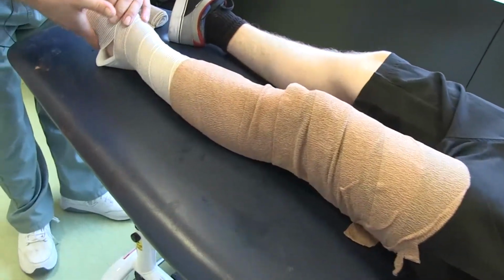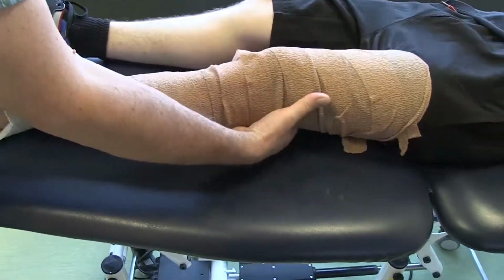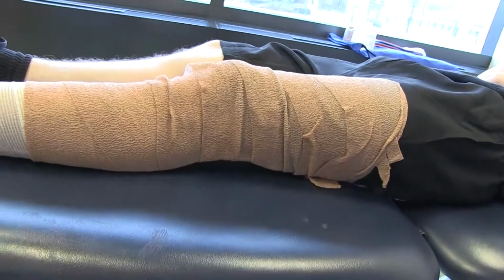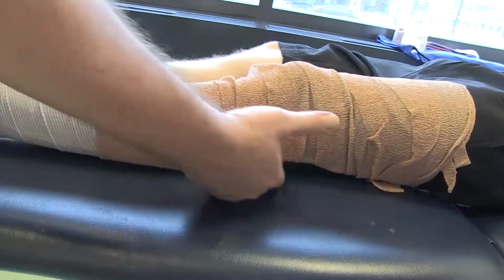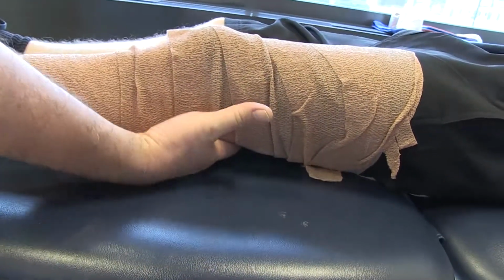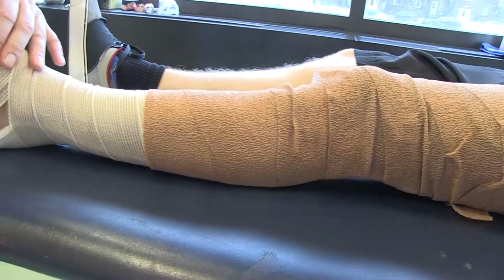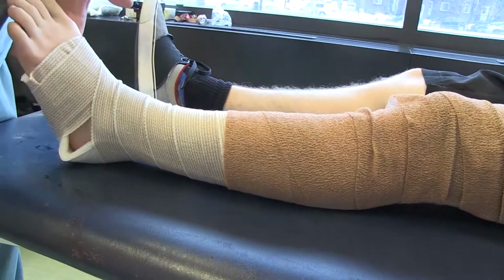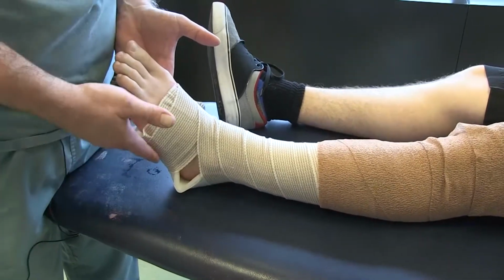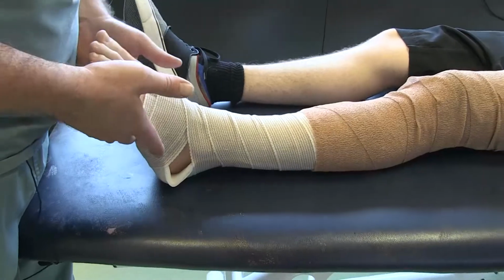What I would like to add is that when you finish the brace, that's the moment to position the patient the way you want them immobilized. So ideally, the foot is at a 90 degrees angle. We could add a little cushion under the knee, depending on the patient's level of pain. Now we wait until it hardens. 3-5 minutes. It could take 3 to 6 minutes. I had used quite cold water, so it could take 5 minutes.